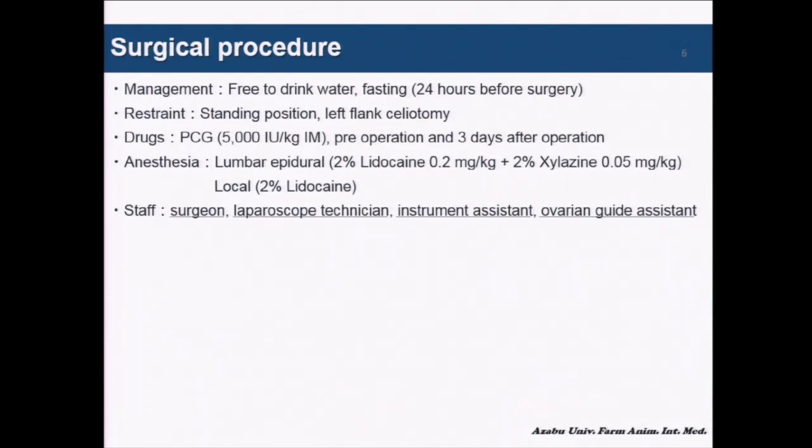Next is the surgical procedure. After fasting for 24 hours before surgery, the cows were restrained in the standing position, and we made the incision in the left flank. Anesthesia consisted of lumbar epidural anesthesia and local anesthesia at the incision site.